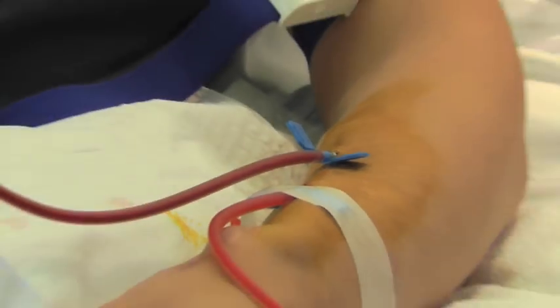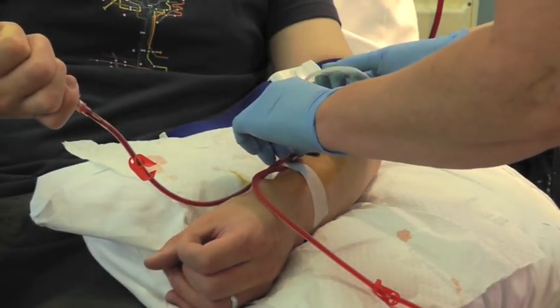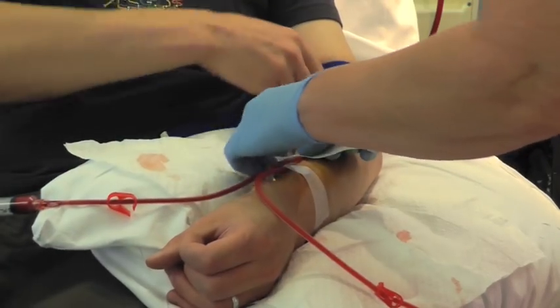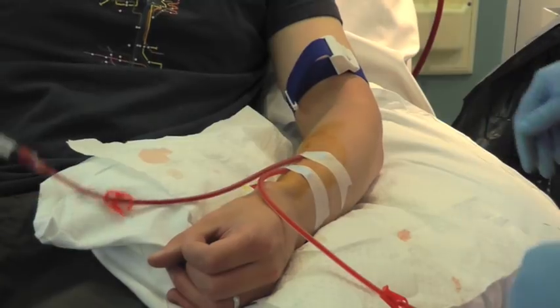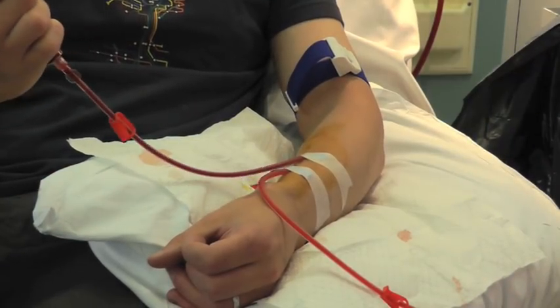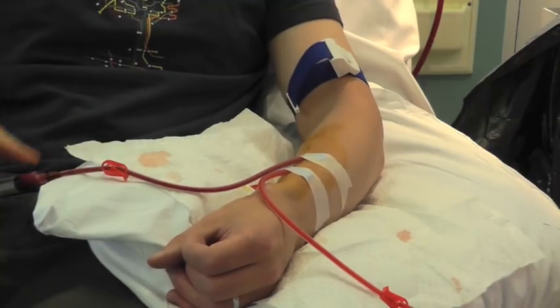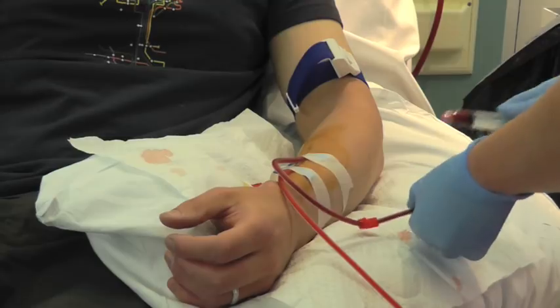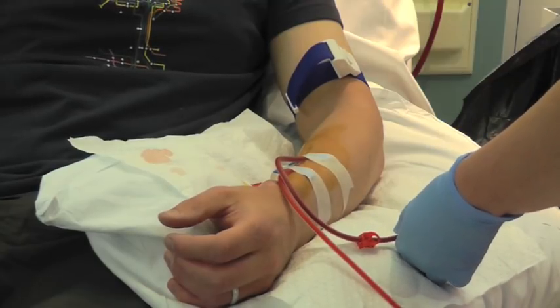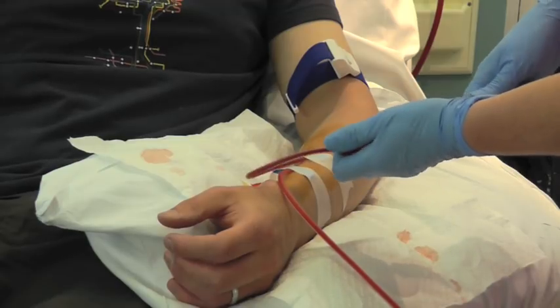If you needle at a steeper angle than this you will tend to go through the opposite side of the fistula and blow the fistula. You should be careful not to push the needles right up to the hub otherwise you will get a little ridge forming around the edge of the buttonhole. This is commonly called hubbing, so you should be careful not to push the needle to the end. You will find that you need to use sharp needles 6-8 times before swapping to blunt needles.